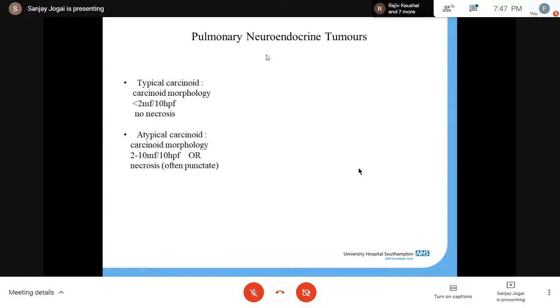Now, with that sort of background to the slide seminar, I'll just go ahead talking a bit about the neuroendocrine tumors. Now, we all know, as far as neuroendocrine tumors in the lungs are concerned, we have typical carcinoid, atypical carcinoid, large cell neuroendocrine carcinoma, and small cell carcinoma. Now, with typical carcinoid and atypical carcinoid, morphology is not too distinct in the sense that they still show Zellballen pattern or nesting or organoid appearance. It is the mitotic count and the presence or absence of necrosis.